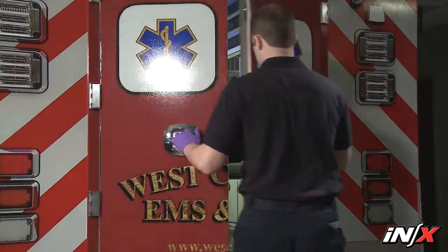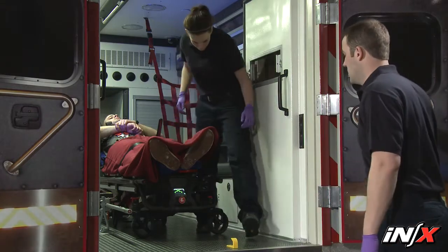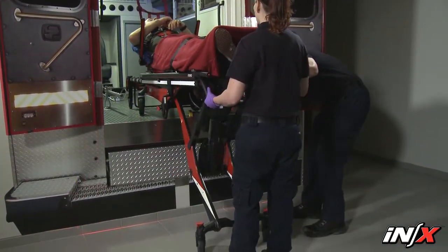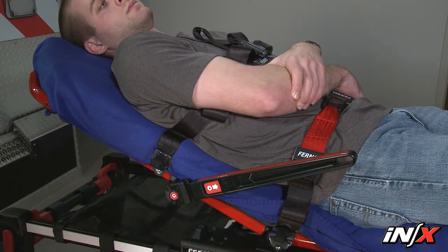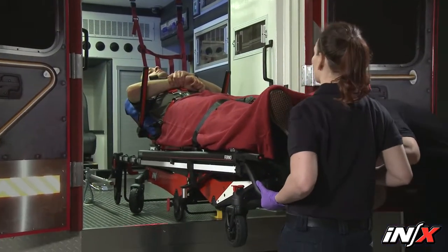The control end operator must support and balance a portion of the load as the control end legs are extended during the process of unloading the NX from an ambulance. The amount of weight that the operator must support and balance is higher when the patient is sitting upright with the backrest raised than when the patient is lying supine.